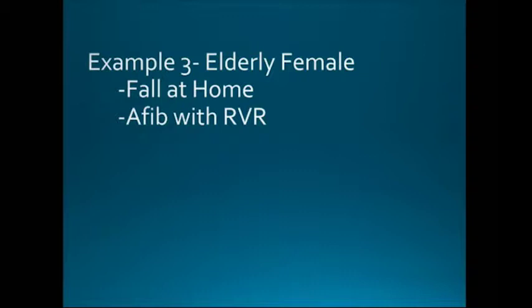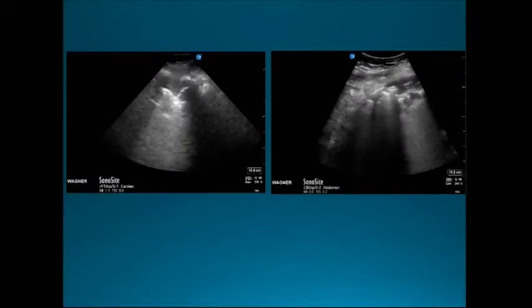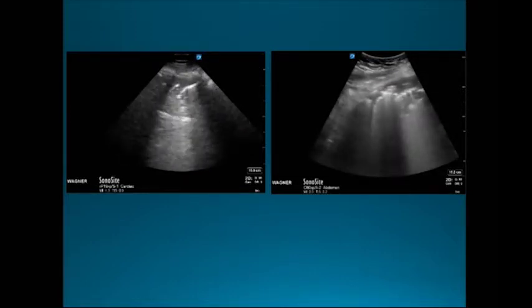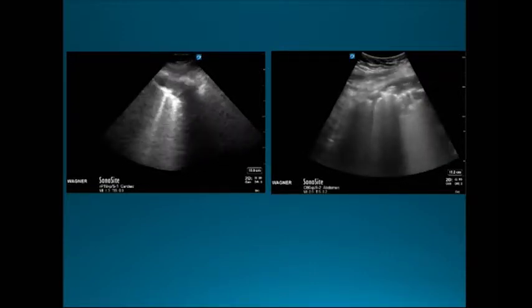And then they get labs and x-rays and things like that, and all that stuff starts to come in, and they recognize, maybe she has sepsis, and we've got to start treating for sepsis. But if somebody had incorporated lung ultrasound as part of their physical exam and their evaluation as part of the initial assessment, they would have seen something that looks like this. This is holding the ultrasound probe on her right-hand side along the anterior chest and sliding from superior down to inferior, and you see this little chunk that's taken out right in here.